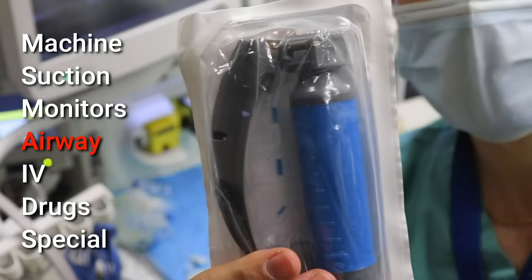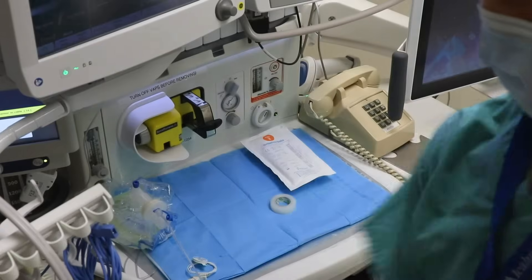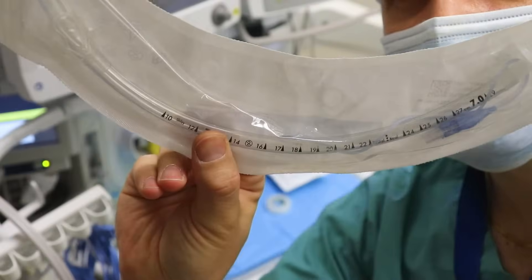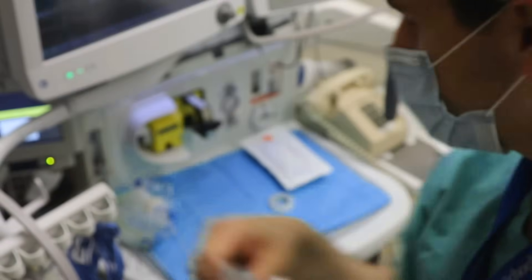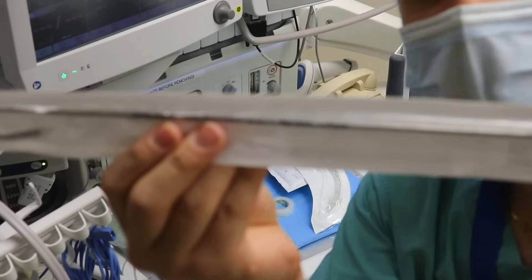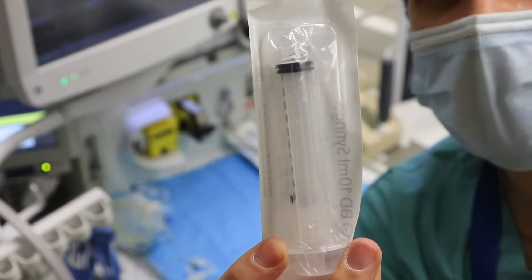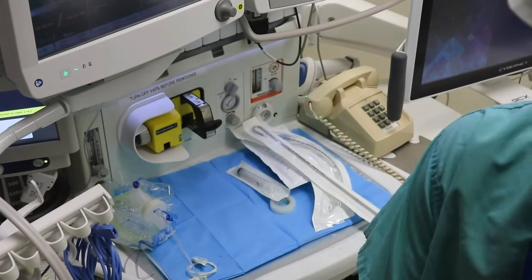Next up is A for airway. I'll start with a MAC 3 blade — you choose your blade size depending on the patient's height, weight, and gender — and also an endotracheal tube. This is a 7.0 internal diameter tube, also dependent on patient height, weight, and gender. I've got a stylet which is not necessary but may make intubation easier depending on your preference, and a 10cc syringe which I'll fill with air to inflate the cuff of the endotracheal tube.